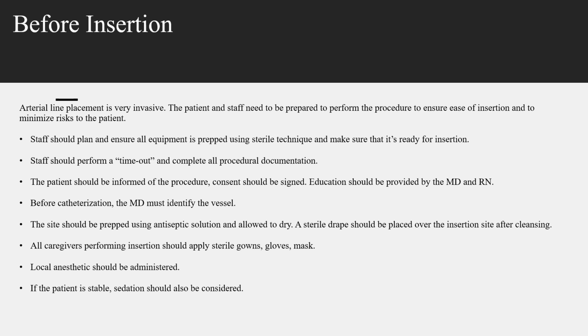Staff should perform a timeout and complete all procedural documentation, especially if sedation is going to be used as well. And again, this is an invasive procedure. Typically, there should be consent that's signed. If it's an emergent thing, we assume that there's implied consent. But if possible, we should get consent either from the patient or family, and that should be signed ahead of time. And education about risks and benefits should be provided by the doctor, and the RN can witness that.